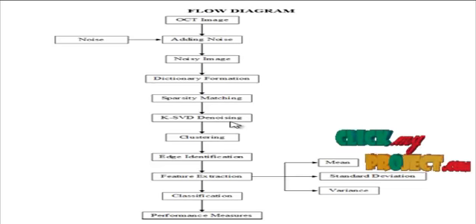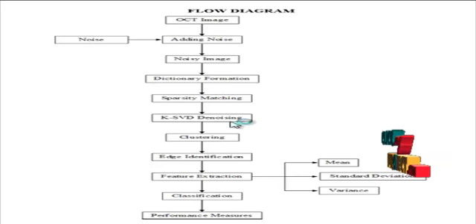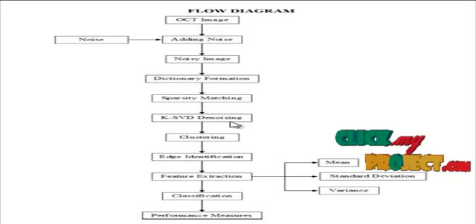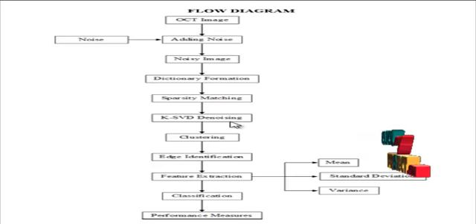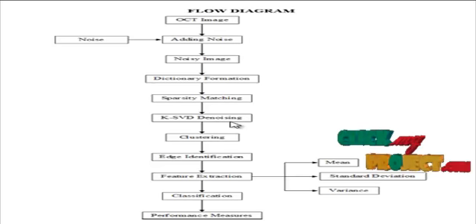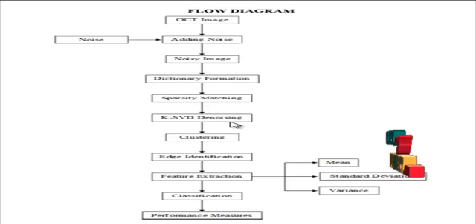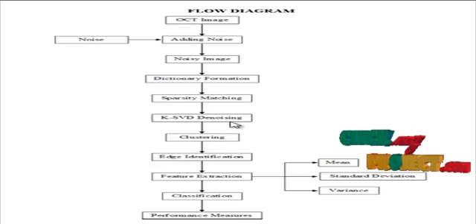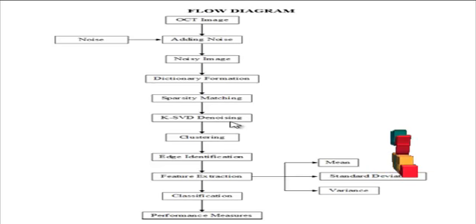The clustering method is based on the identification of the difference between the input data, and based on the difference the clusters were assigned. By comparing the dictionary patches and the original patches, the noises in the images were estimated.